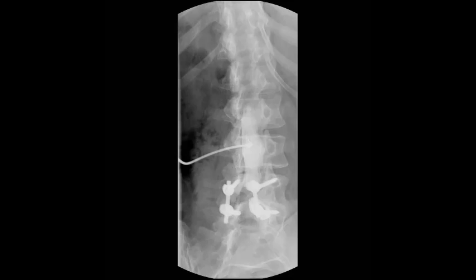As I mentioned, this patient was a myelogram and not an actual lumbar puncture. I used this patient and the contrast injection to demonstrate the position of the thecal sac while the patient is obliqued. Take notice of the relationship of the needle to the thecal sac. There's actually more thecal sac to the patient's right.